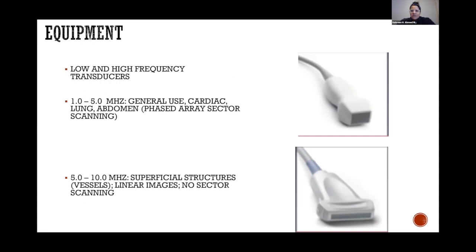So what kind of equipment do we use in order to identify some of that pathology? For those of you who already use ultrasound, you may be familiar with the fact that there are 3 different ultrasound probes, but I'm showing you 2 here. Really the main distinction between ultrasound probes is their frequency, low frequency and high frequency transducers. We use the terms probe and transducer interchangeably. Low frequency transducers or probes can see structures with great depth. High frequency really focuses on structures that are superficial.